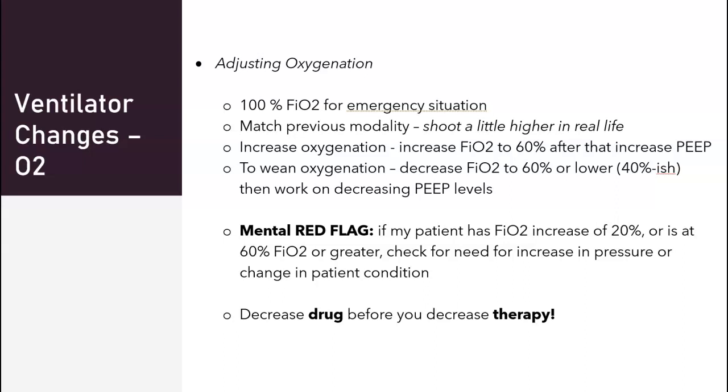And then when I'm weaning, decrease your FiO2, because your oxygen is considered a drug, before you decrease your therapy, which is your pressure. Pressure, PEEP, any of that is considered a therapy. So decrease your drug before you decrease your therapy.